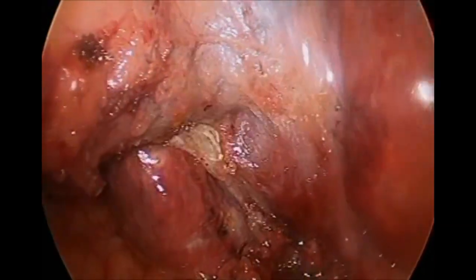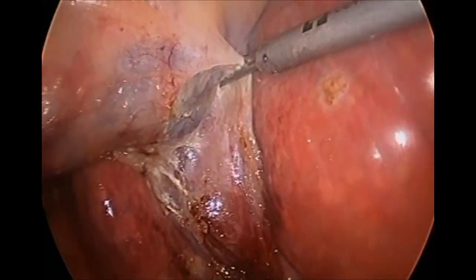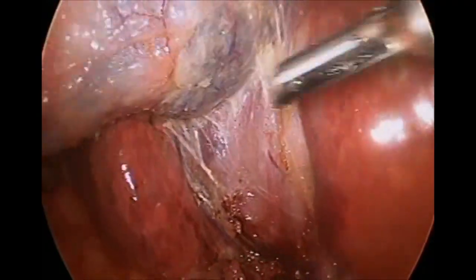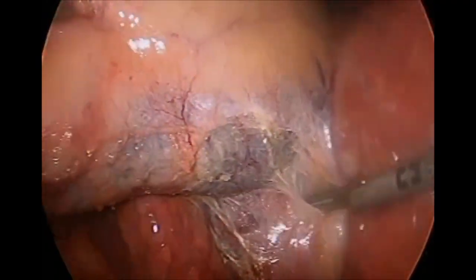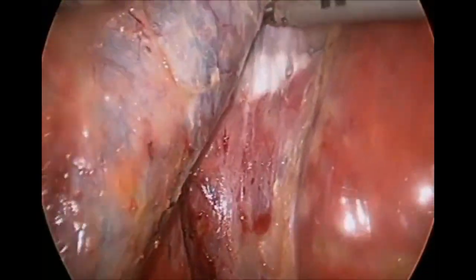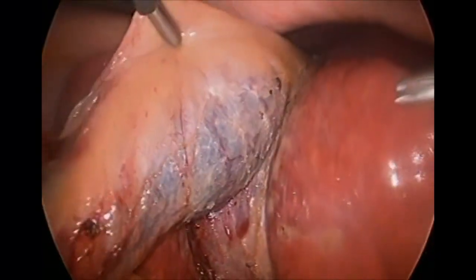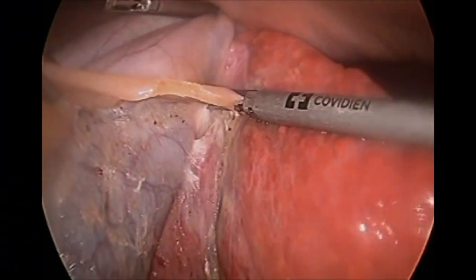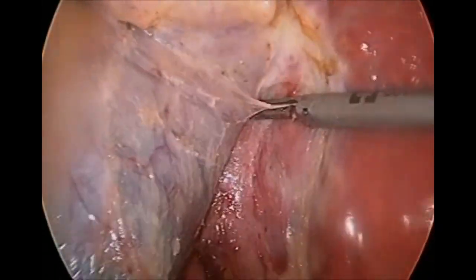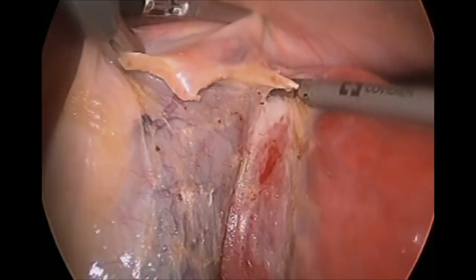And as you can see here, now the Sonicision is controlling the bleeding very nicely. And here now we're using a combination of sharp and blunt dissection. And the gallbladder is very dilated, very distended. It's bigger than the usual size gallbladders.